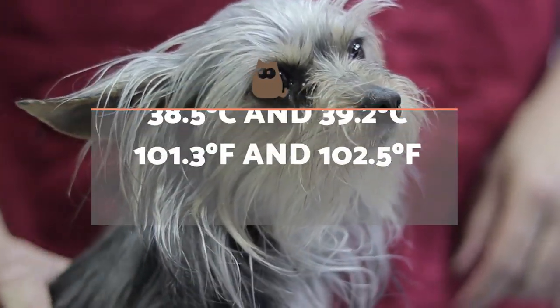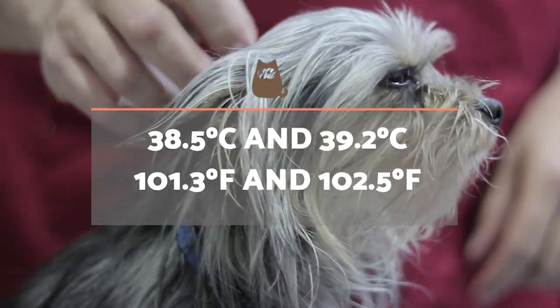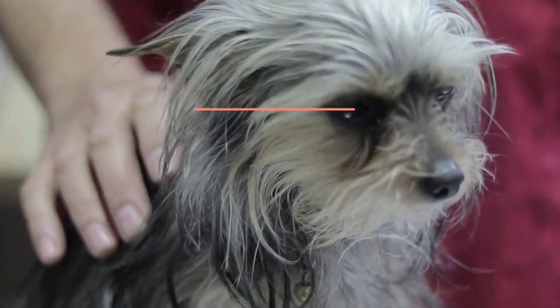When taking a dog's temperature, we must first know that their normal reading is between 38.5 degrees centigrade and 39.2 degrees centigrade, or 101.3 degrees Fahrenheit and 102.5 degrees Fahrenheit.